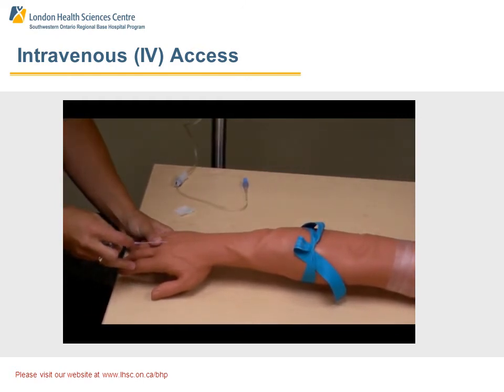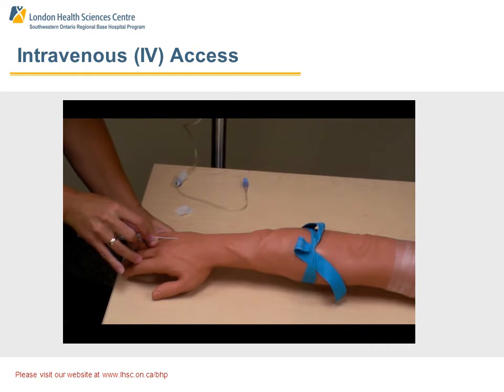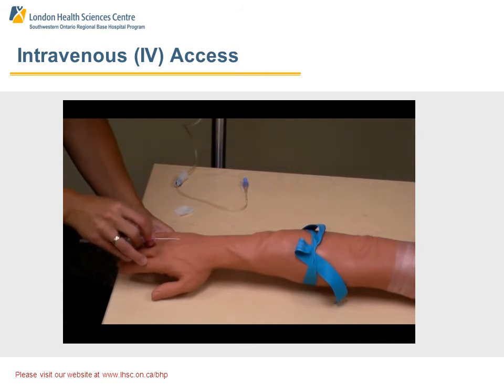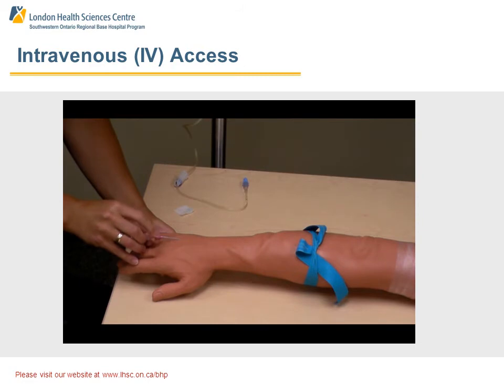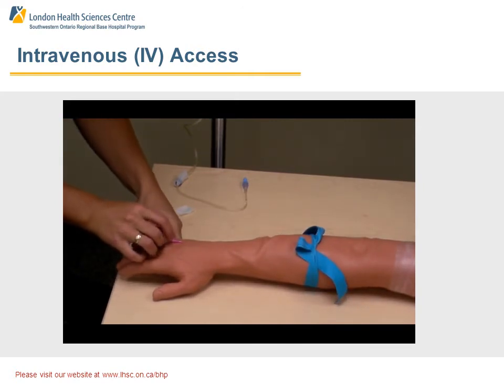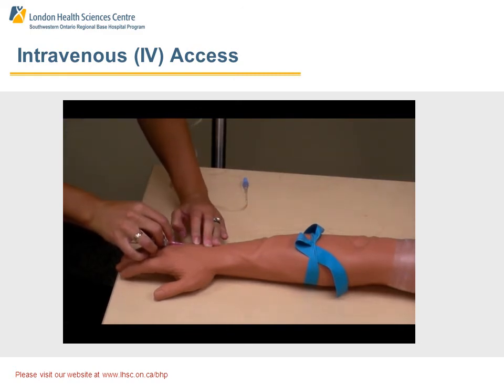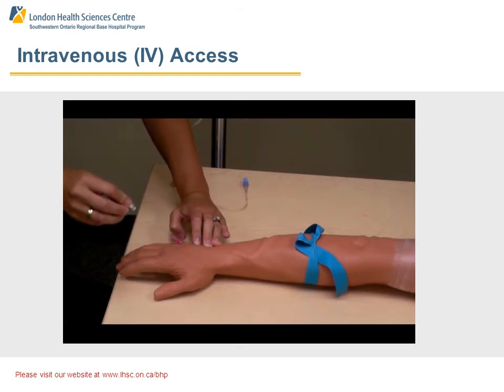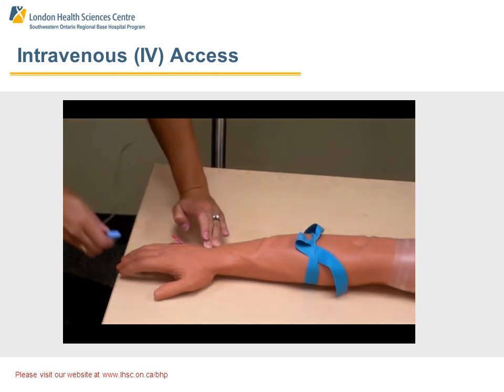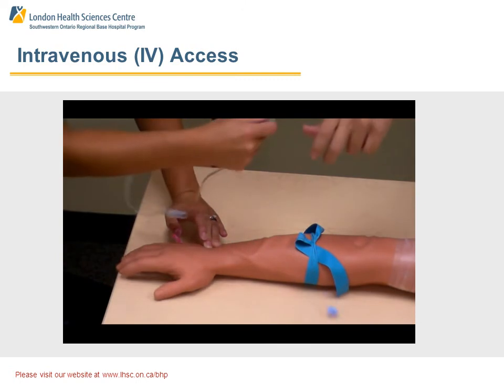There are different techniques, and that's whatever you've become comfortable with. I prefer the more horizontal method to avoid going through the vein since they aren't that large in diameter. When you go in horizontally, you can use your other fingers to anchor yourself on the patient's hand. Once you enter the vein and feel a little bit of a pop, go ahead and advance the catheter itself a few millimeters, and then advance the entire needle unit. What Steph did there was advance the catheter just past the tip of the needle when in the vein, so that when she advances the entire unit, the tip of the needle doesn't puncture through the wall of the vein. Next, occlude the vessel proximal to the site and remove the needle itself, discarding it in a sharps container.